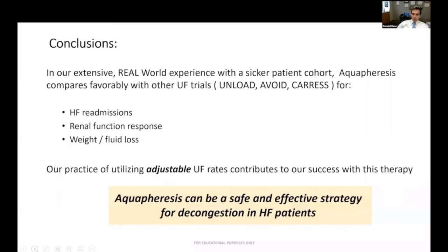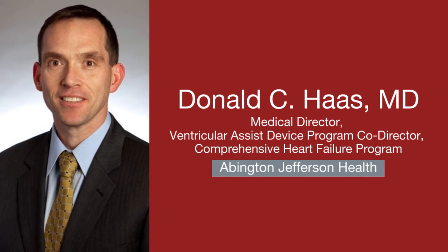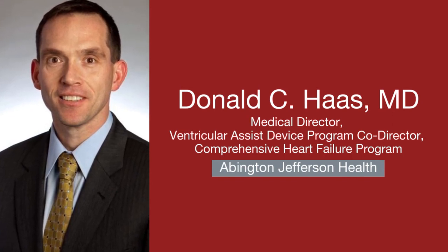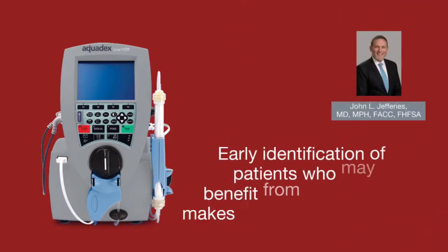In addition to confirming what you think their intravascular volume status may be, and of course sometimes you can be surprised by that, you learn what the cardiac index is. And even if their index is down, it doesn't mean that you can't do ultrafiltration. But it often means, in our experience, that you definitely need to have some kind of support, either with milrinone or dobutamine, in order to get them through the ultrafiltration session. It's typically going to be better.